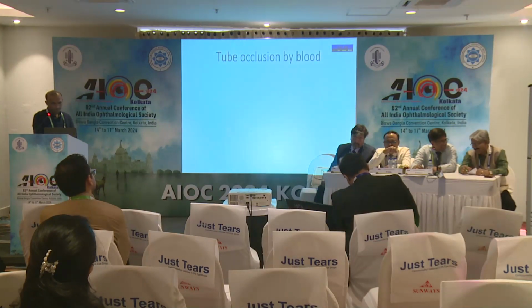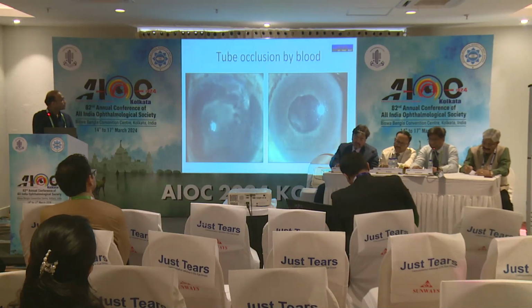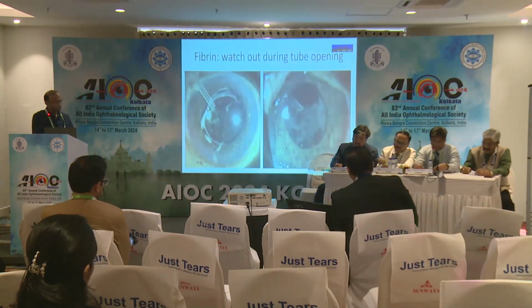Postoperatively, tubes can get occluded by various materials including blood, fibrin, vitreous, lens capsule, etc. Most of these resolve with conservative measures.